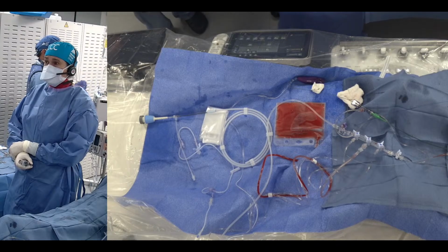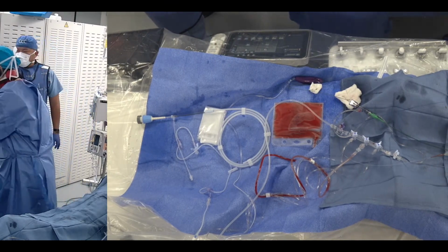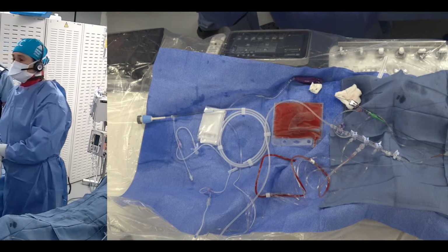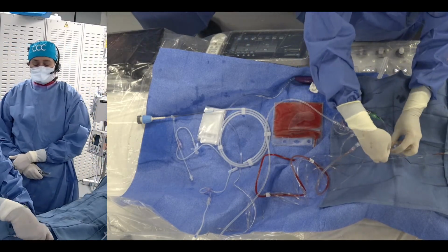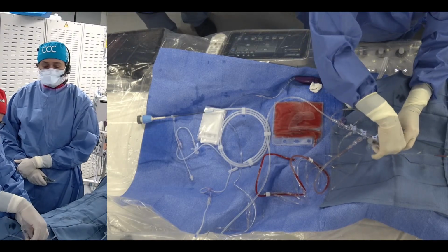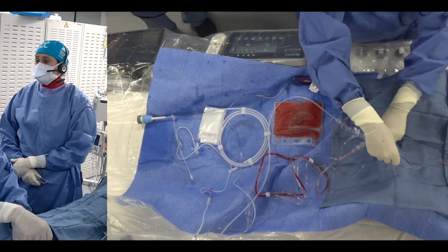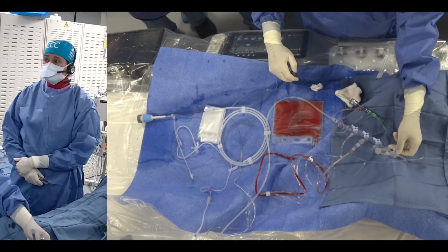So very important, point number 1, 100% pure contrast. We are going to take it from the manifold.